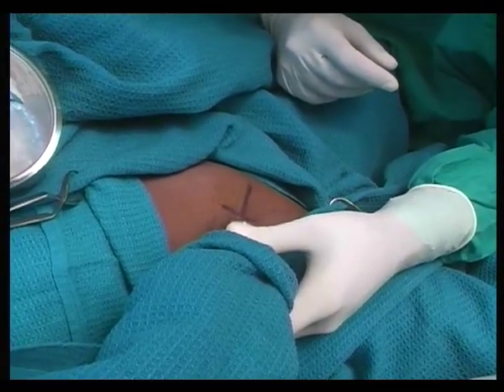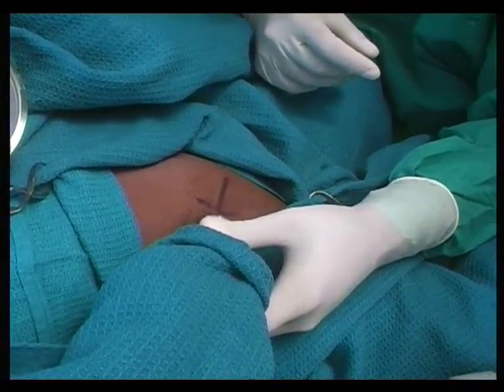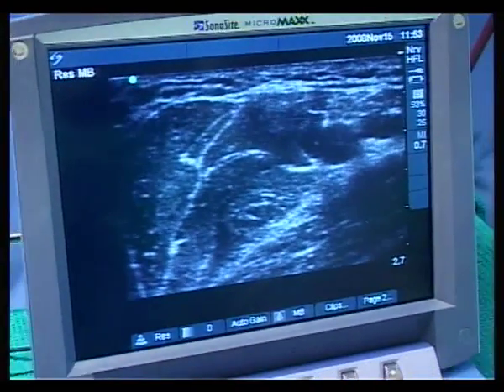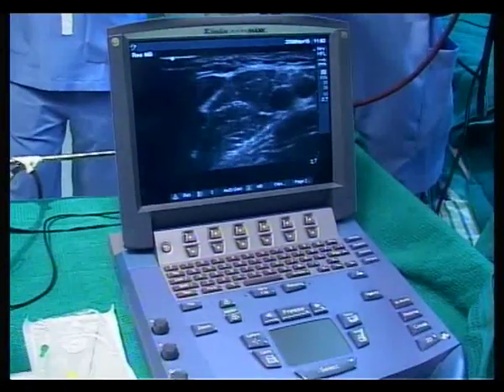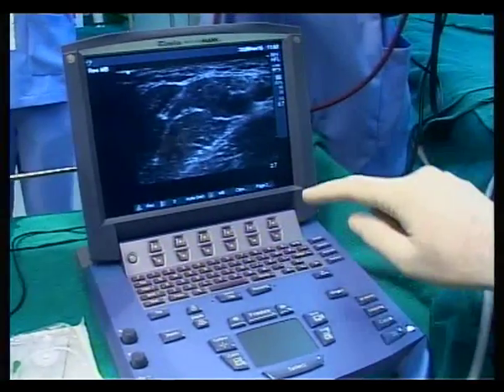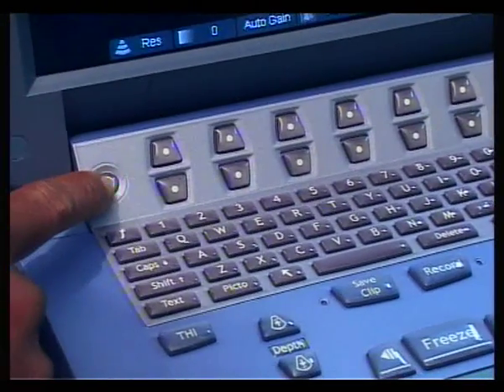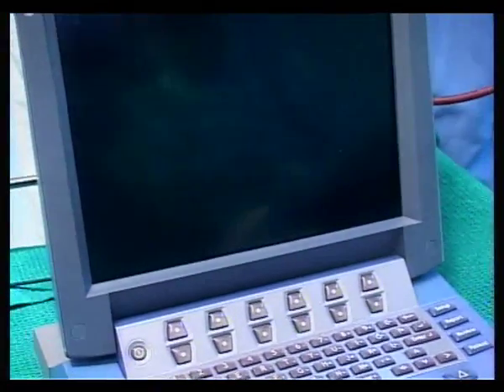We need to set the ultrasound machine first for appropriate settings to get a good view of the axillary artery, the axillary vein, and the brachial plexus around it. If you focus on my finger, this is the power on/off switch. I'm switching it off and will switch it on to show you what adjustments we have made.